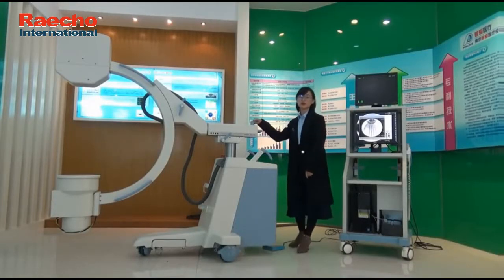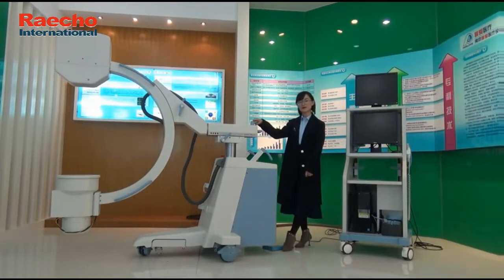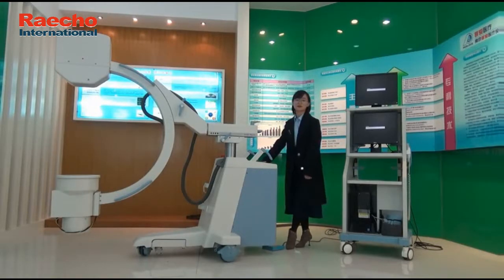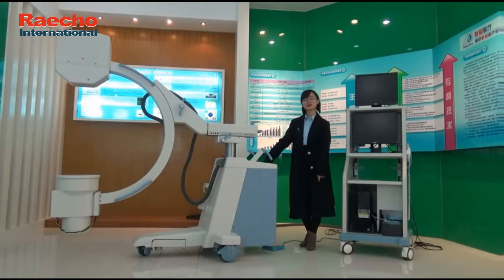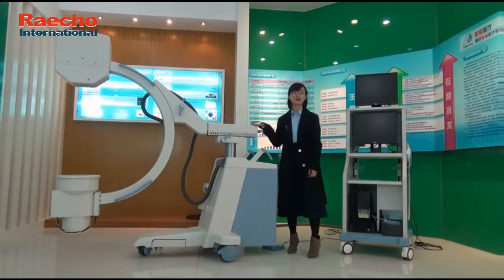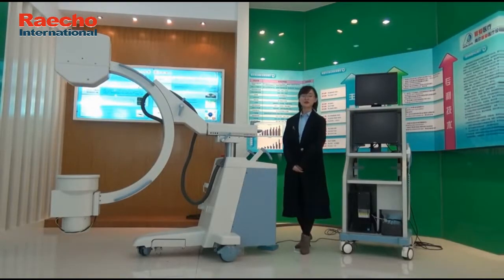Our PLX-112B uses a new C-arm design — compact, beautiful, exquisite, and flexible — which brings a superior experience for doctors. The friendly interactive interface with humanized operation performs more intelligently and conveniently. It has a variety of parameters to choose from which meet the device needs of customers. The high quality with a reasonable price makes this machine competitive in the market. We are willing to join with you to care for life and health. Thank you.